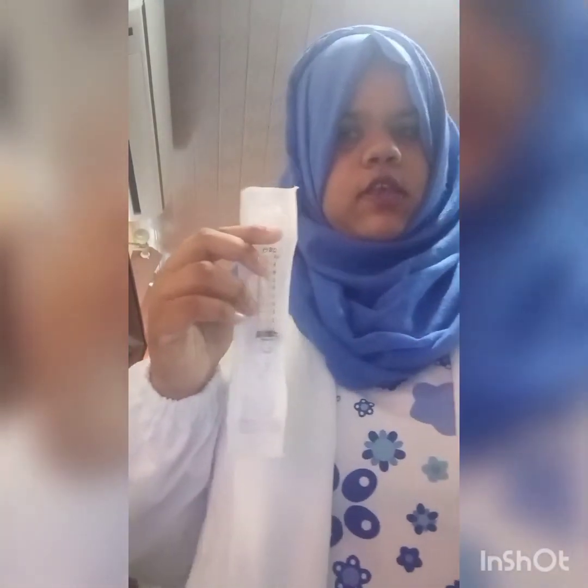The equipment and supplies used by a phlebotomist. First, we have the phlebotomy chair. I have some things that we use as phlebotomists in the hospital, which are the blood collection tubes, our gloves, the non-sterile gloves, an assortment of needles, and well, this is the needle and this is a syringe. So it's an assortment of needles and syringes.